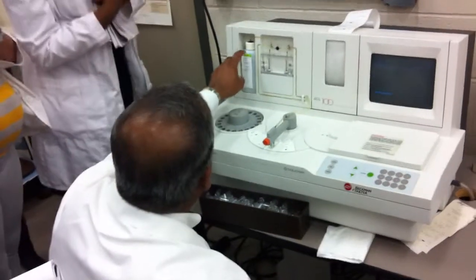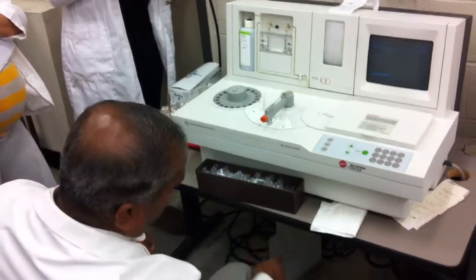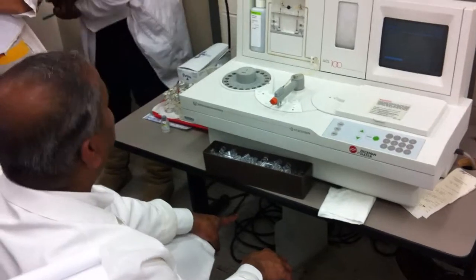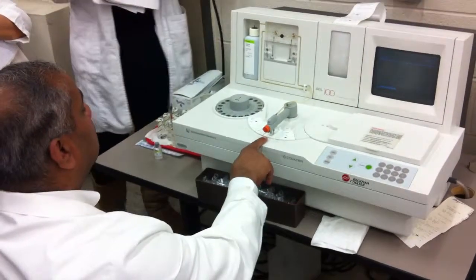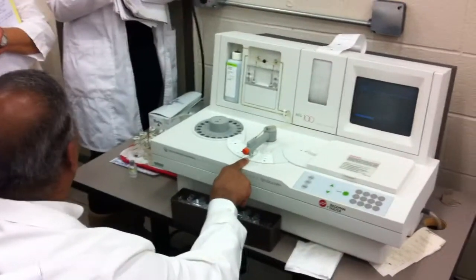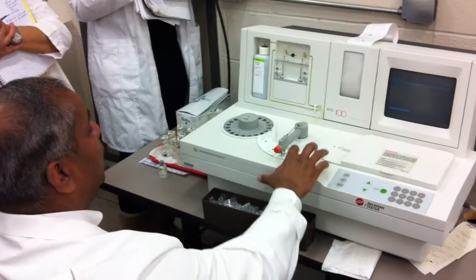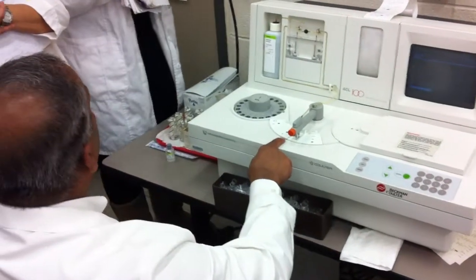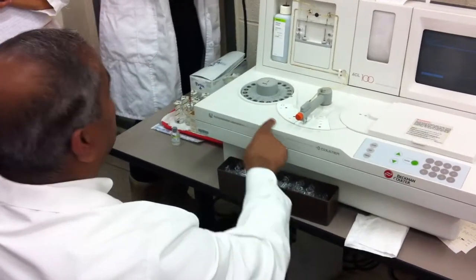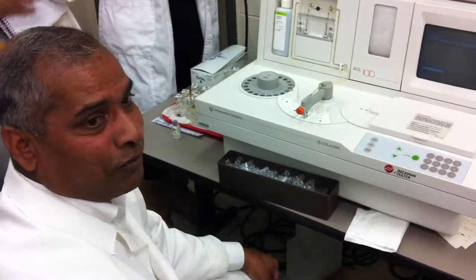Injection fluid. This is the fluid that's used to rinse everything in here. And it actually goes out through a tubing, and it's collected in a waste container at the bottom. Okay? And you will know if it backs up, it's going to overflow right there in the reagent well here. If this overflows, then you see how this is so tight? It gets to the covers, and then it contaminates all of your wells. So if you're not paying attention and it overflows, then you have to change everything.